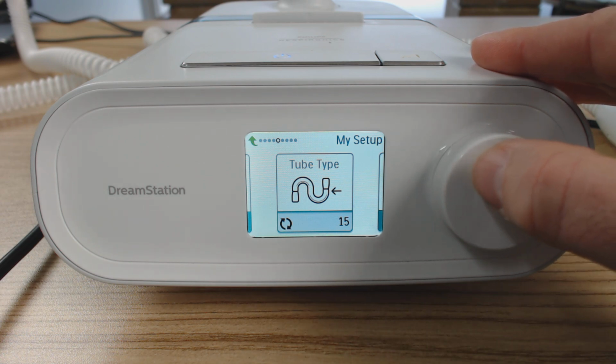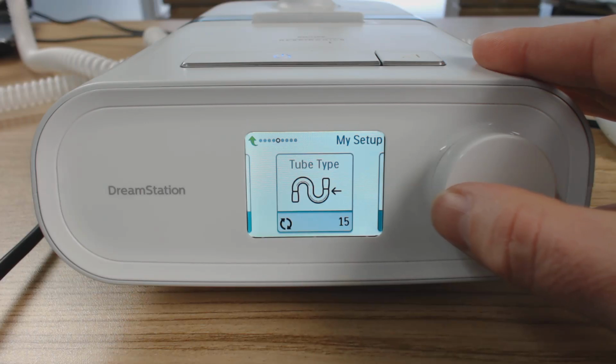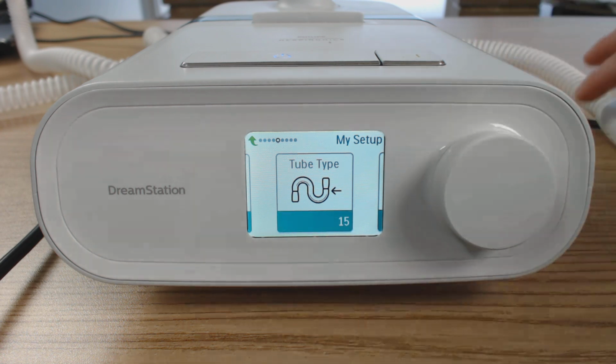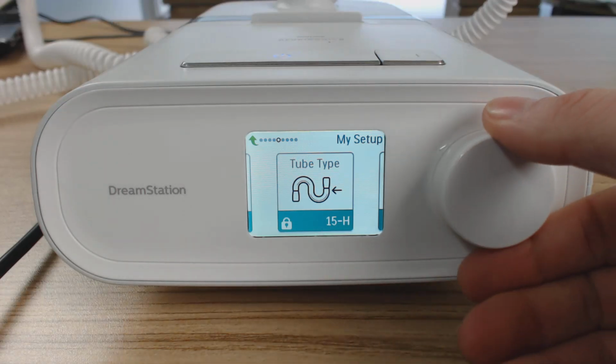It normally says around the rim that connects to your mask what size it is, but otherwise just measure. If it's thin, it's 15. If it's a bit thicker, it's 22. All right, but we're going to put this in, and it just locks it at 15mm heated tube. That's all you can get when it's heated tube.